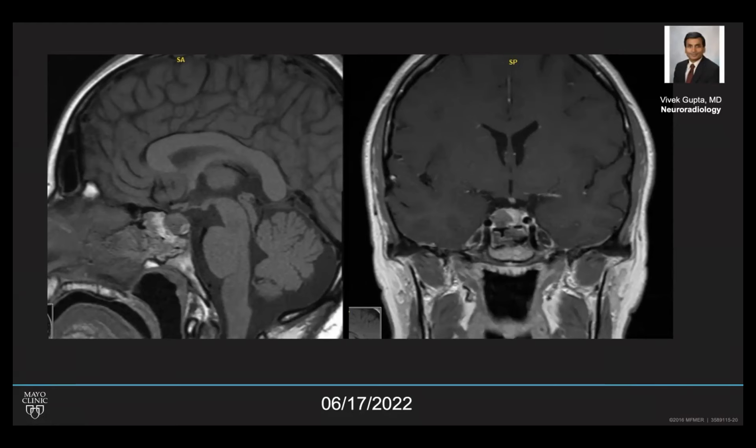As you mentioned, Dr. Q, very excellent point on the preoperative imaging. There was that hypo-intense band, and one of the things that we make sure to do when we look at these, and I see that we included it on this slide but maybe not on the preoperative slide, is we always include the pre-contrast T1 weighted imaging, because if you look only at the post-contrast imaging, it will not be long before you are confused by something that's intrinsically T1 hyperintense, which subacute blood products often are. So that linear division between what was probably enhancing tumor and non-enhancing intrinsically T1 hyperintense blood products was the key to recognizing that there was likely a component of subclinical hemorrhage in that tumor preoperatively.